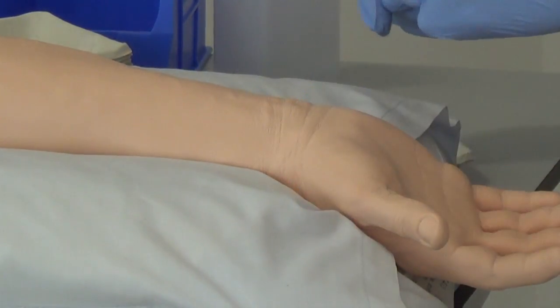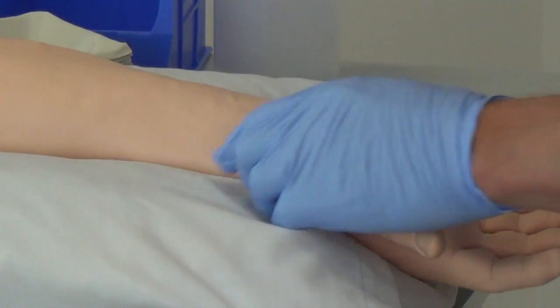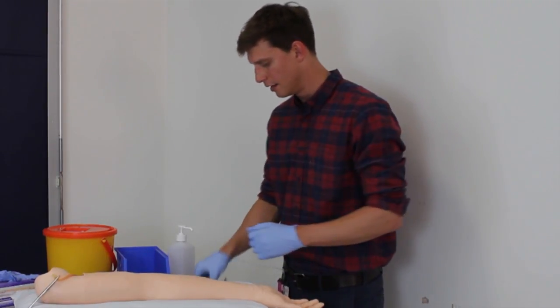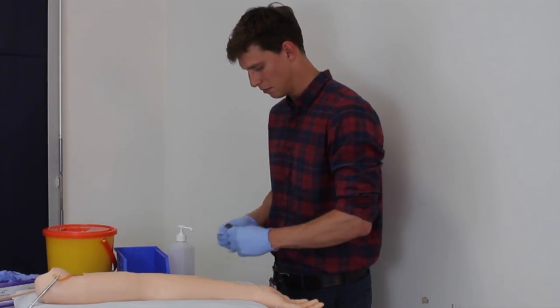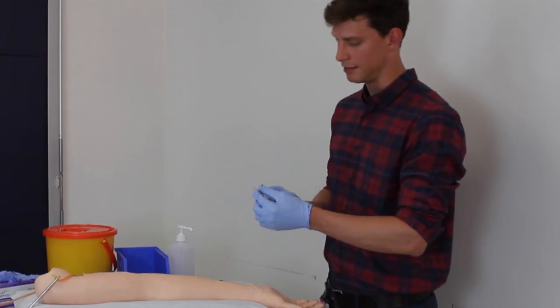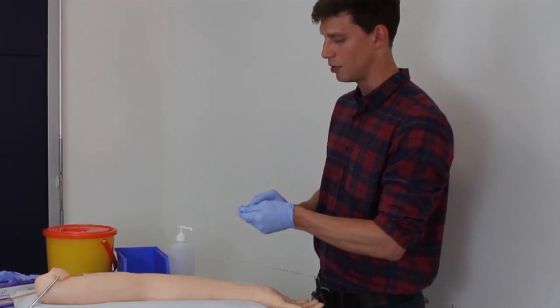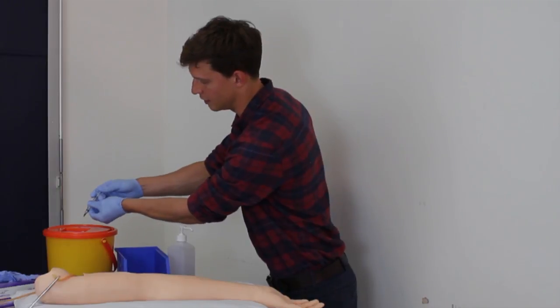I wipe the wrist using one motion down and wait for that to dry for 30 seconds so that it's sterilized. Whilst that's drying I can prepare my equipment. The heparinized syringe comes preloaded with heparin and with the needle already attached. First you need to take the safety cap off the needle and discard the heparin already loaded into the syringe.